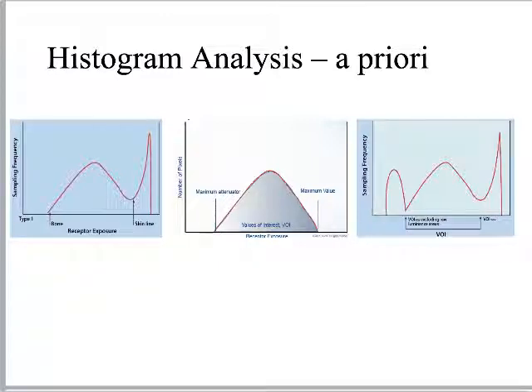It has a database of histograms. So before I ever scanned my film to this pre-processing process, it already knew, when I told it I'm looking at a chest x-ray, what a chest x-ray should look like. That is what we're talking about when we talk about a lookup table. How does it know that? It looks it up in this vast table of histograms and says, okay, this is the model A x-ray, right?